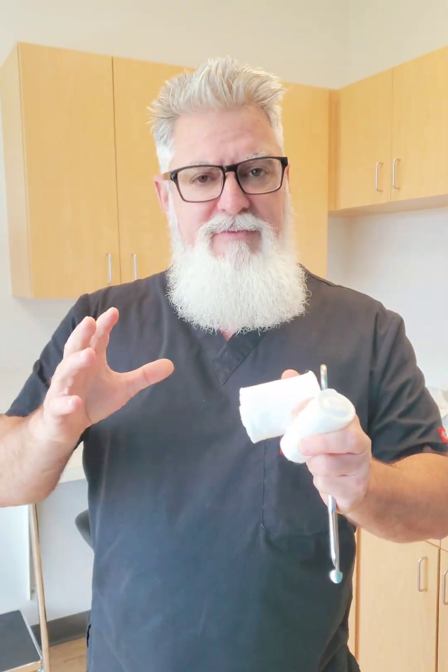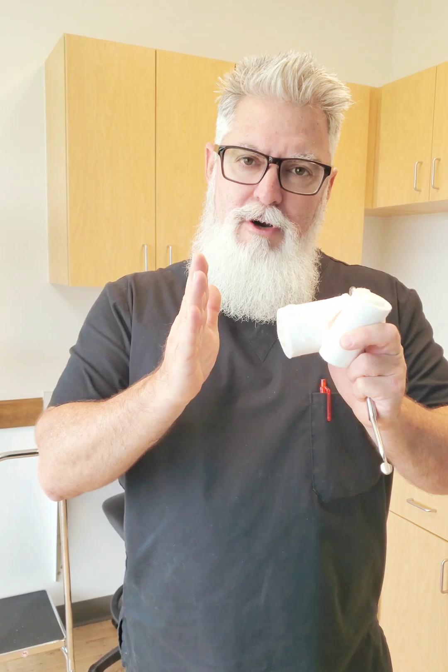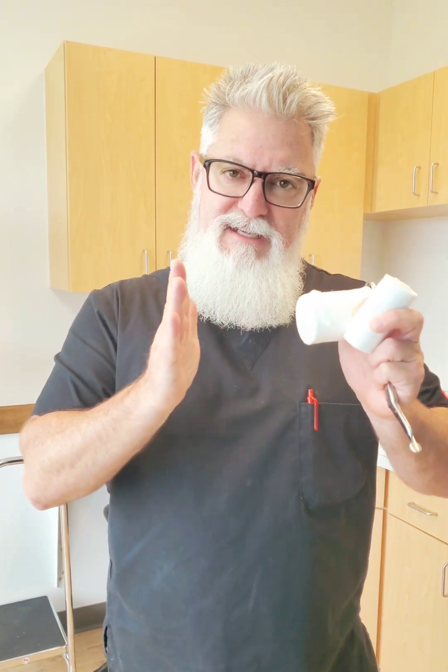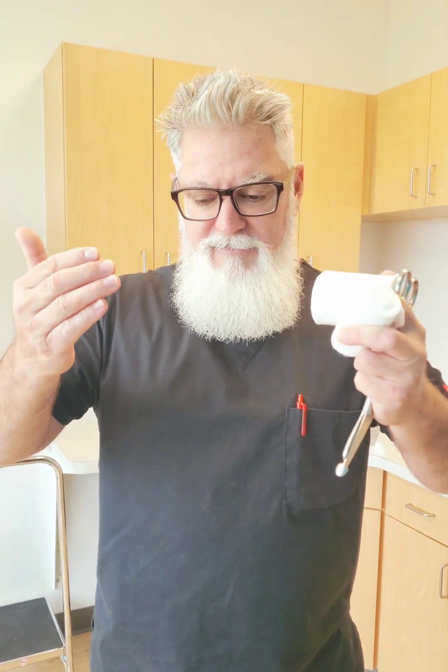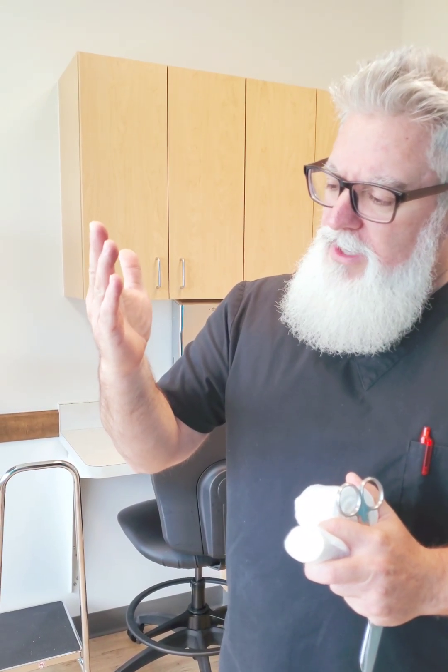They're short videos, very to the point — five, six, seven minutes each. The previous video, if you're keeping up with the series, should be the short arm cast with the interosseous mold. The video we're going to do right now is a short arm cast with an ulnar deviation.